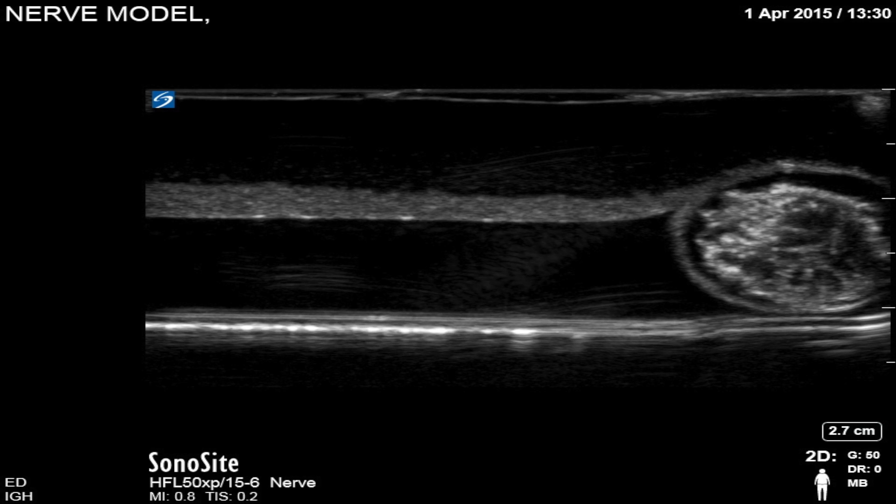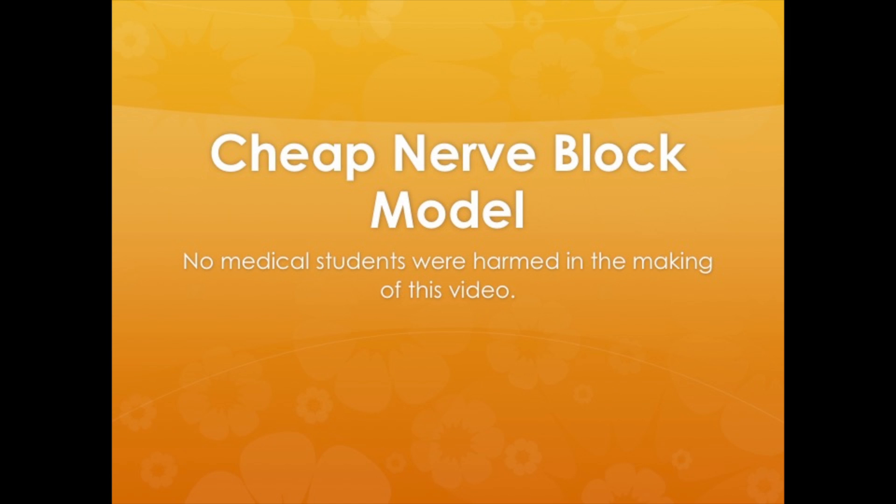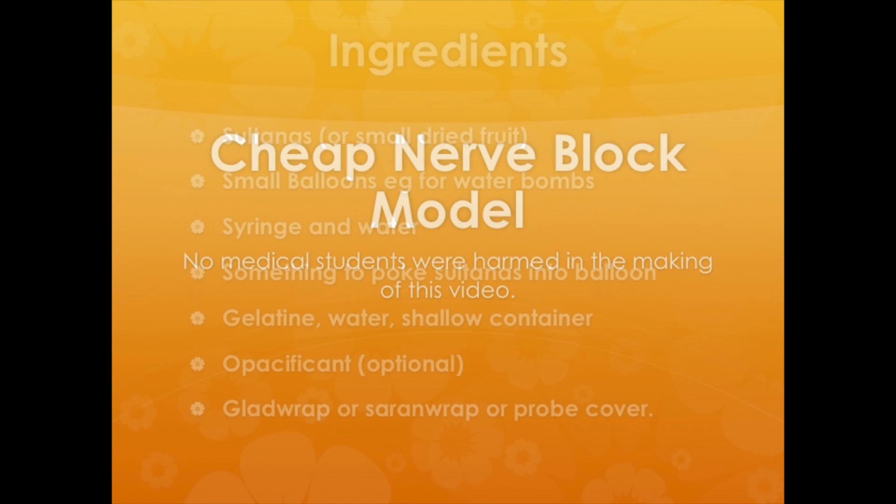Hi, what you can see is a sultana and a little bit of saline in a balloon. This is a quick simple model that we use to make for nerve block practices for our registrars.